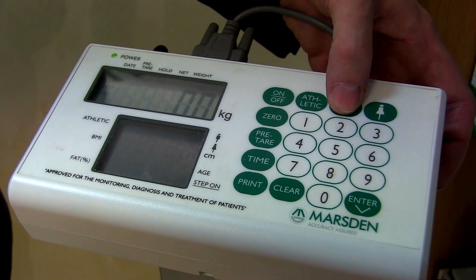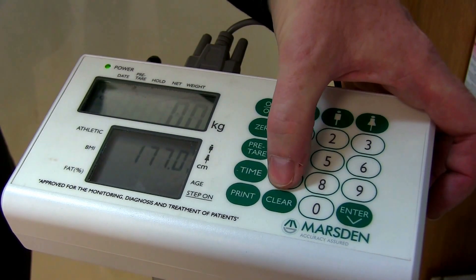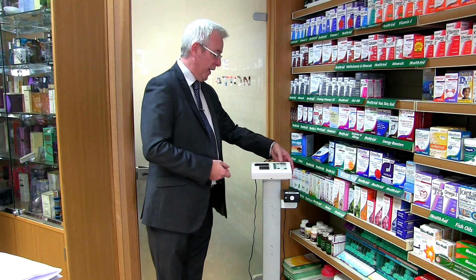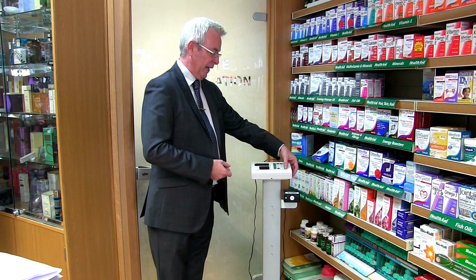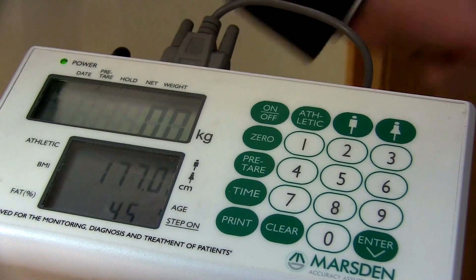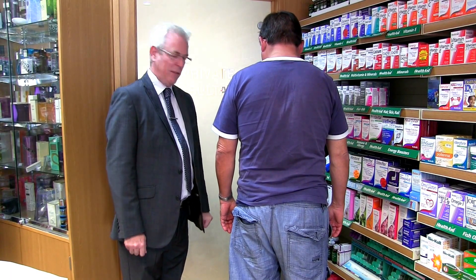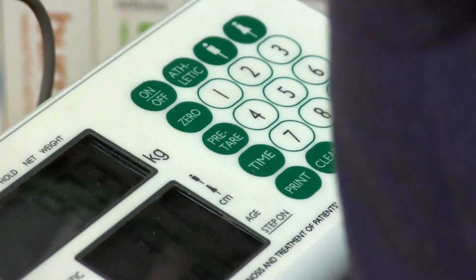Enter gender, height in centimetres, press enter and then enter the patient age, again pressing enter. The scale is now calculating the information and to get the results simply press print.